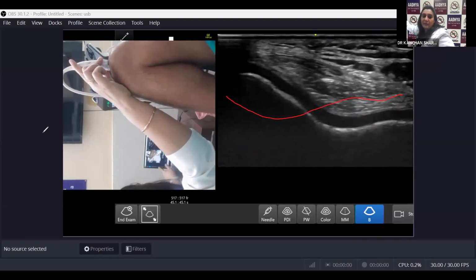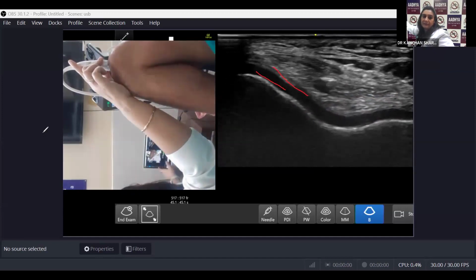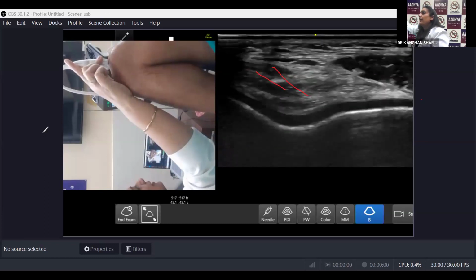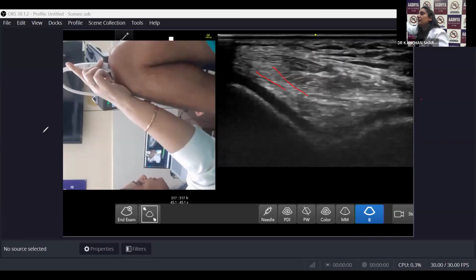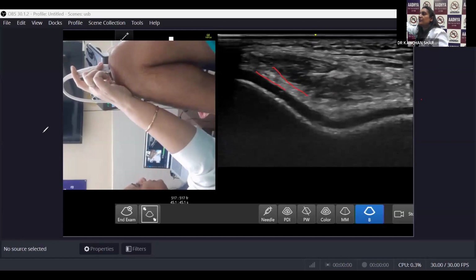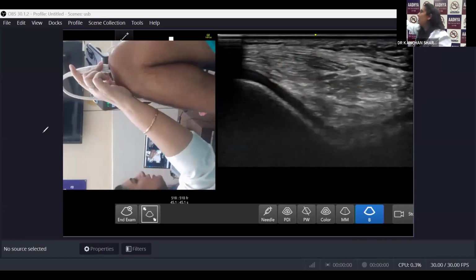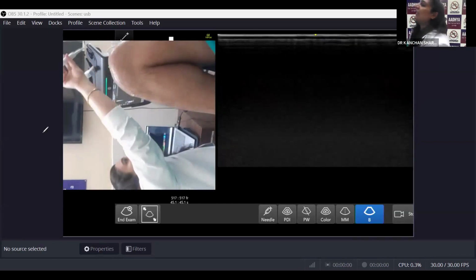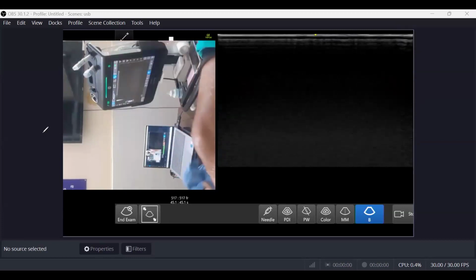Evaluate. Look for any kind of deposit within the cartilage, over it, here or here. That is going to give you an idea about the crystal depositing diseases. And here also you can find your quadriceps tendon, make use of anisotropy. So you will be able to see your quadriceps tendon also. So that's all, I think. When I was looking at the trochlear cartilage, my probe was in short axis, with the aspect marker towards the lateral side. I have a question, Doctora.